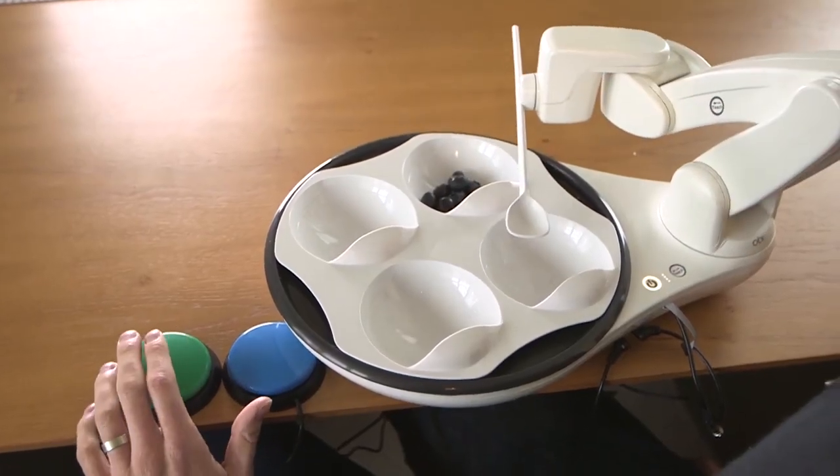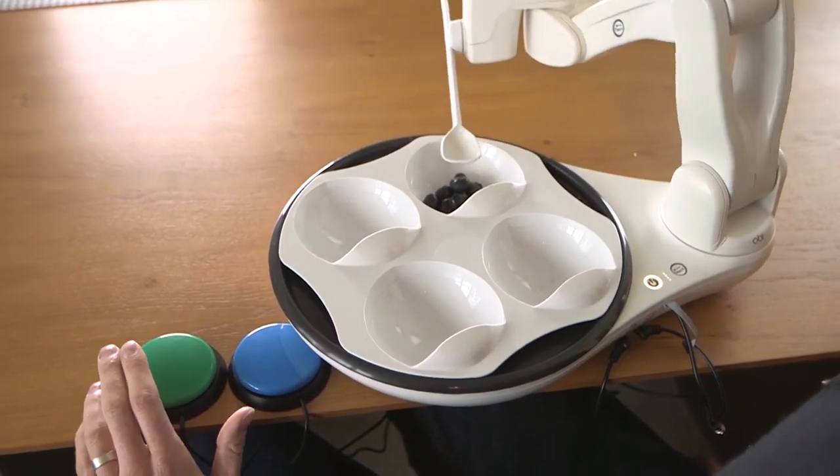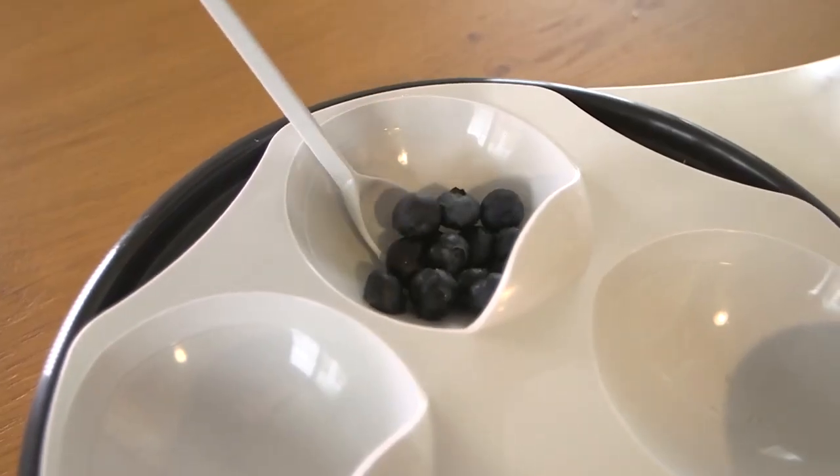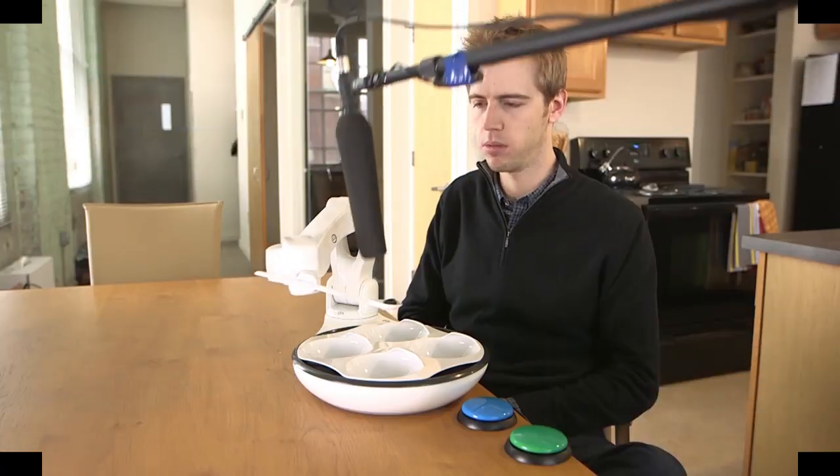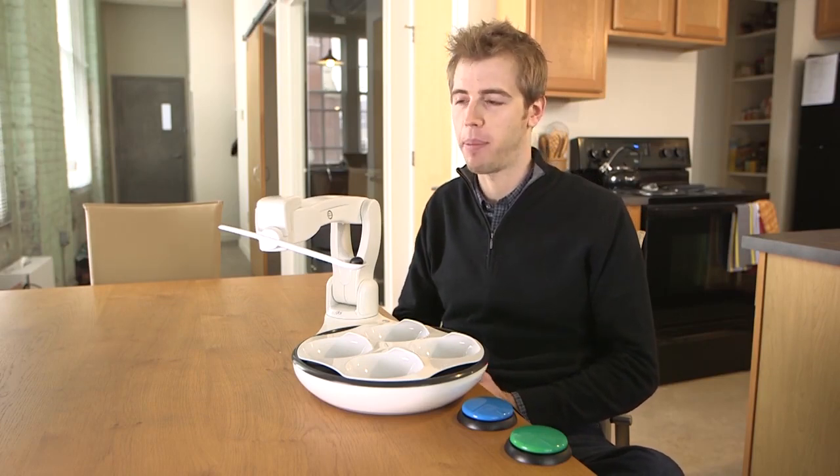You'll first want to press the choose button to select the bowl you'd like to eat from. When you're ready, press the delivery button. OB will scoop through the bowl and bring the food to your mouth. If anything like that were to happen, don't worry — OB will stop, back away, and wait for your command to keep moving.